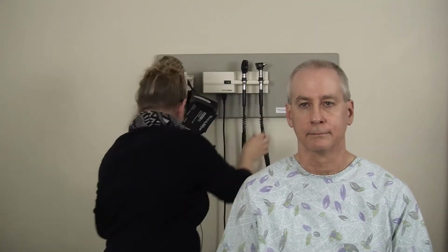Next thing we want to do after using the otoscope is test hearing acuity. That can be done in two different ways. One way is called the whisper test, where you whisper at least a word with 2 syllables. The other way is by just rubbing your fingers in front of the eardrum.